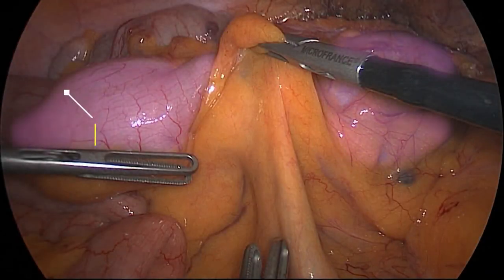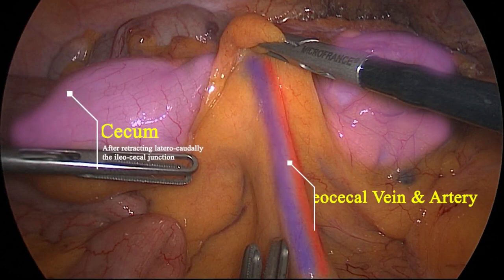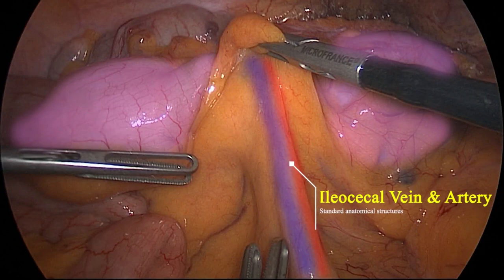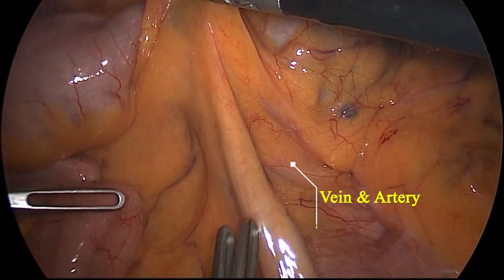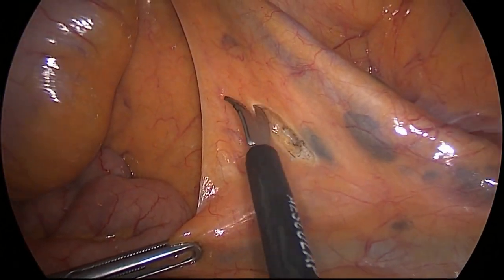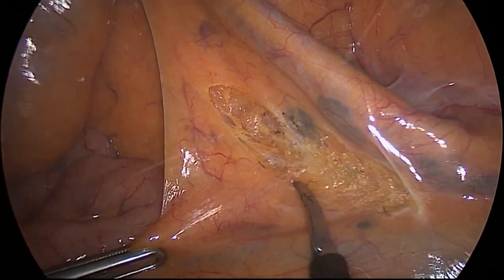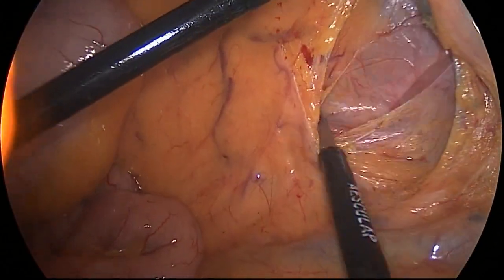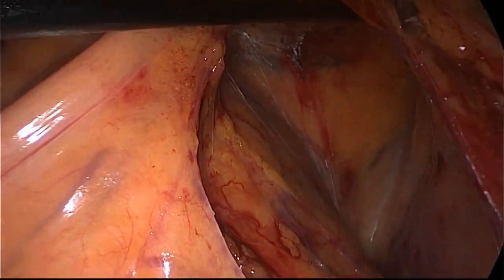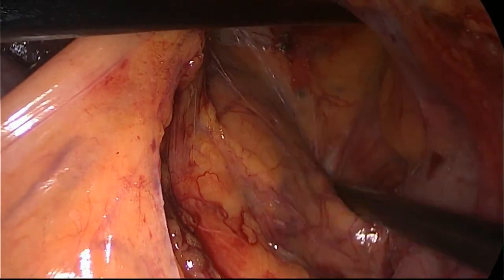We start our operation by retracting the ileocecal junction laterocaudally so the roots of the ileocolic vessels are identified. The peritoneum is opened below the ileocolic vein, as in a classic medial-to-lateral dissection. The dissection is carried through the avascular plane of Toldt between the intact mesocolic fascia and the retroperitoneum until the duodenum and head of the pancreas are visualized.